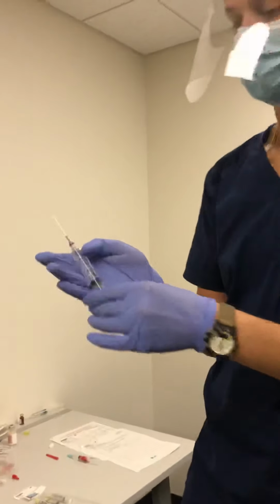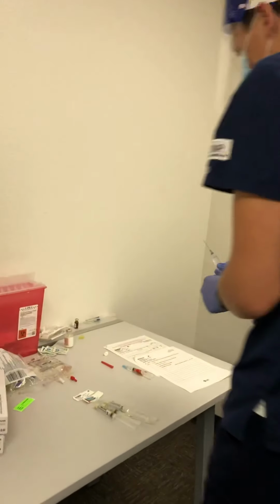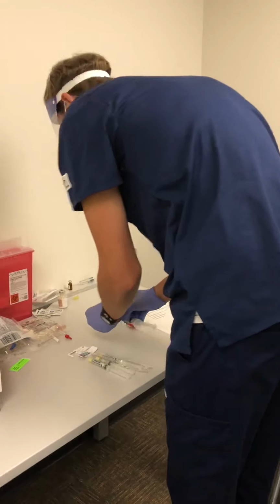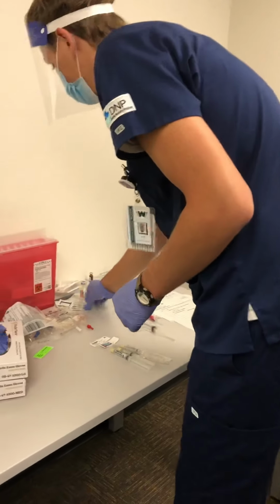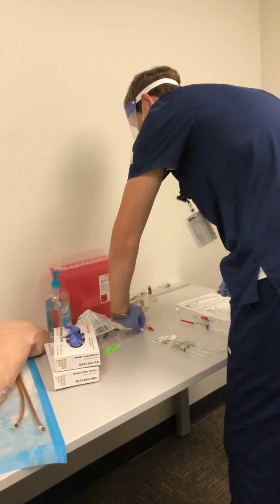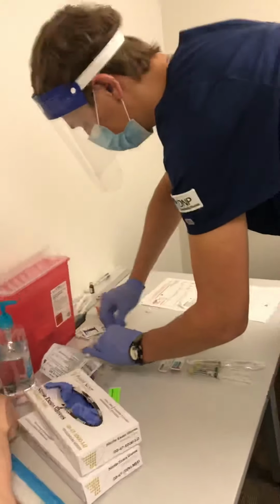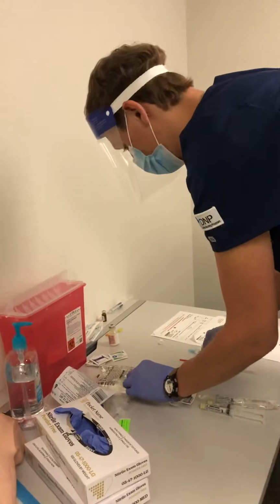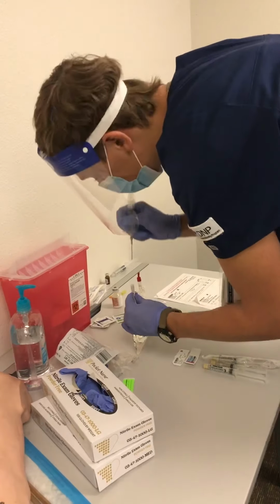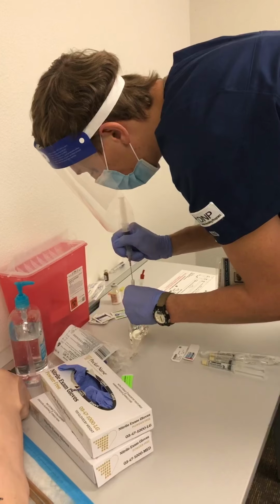I'll just make sure to verify I got my 10 mils here, and clean the hub off of this. Take the needle trap off and make sure to poke this in and instill it straight down, not to poke a hole into the bag.